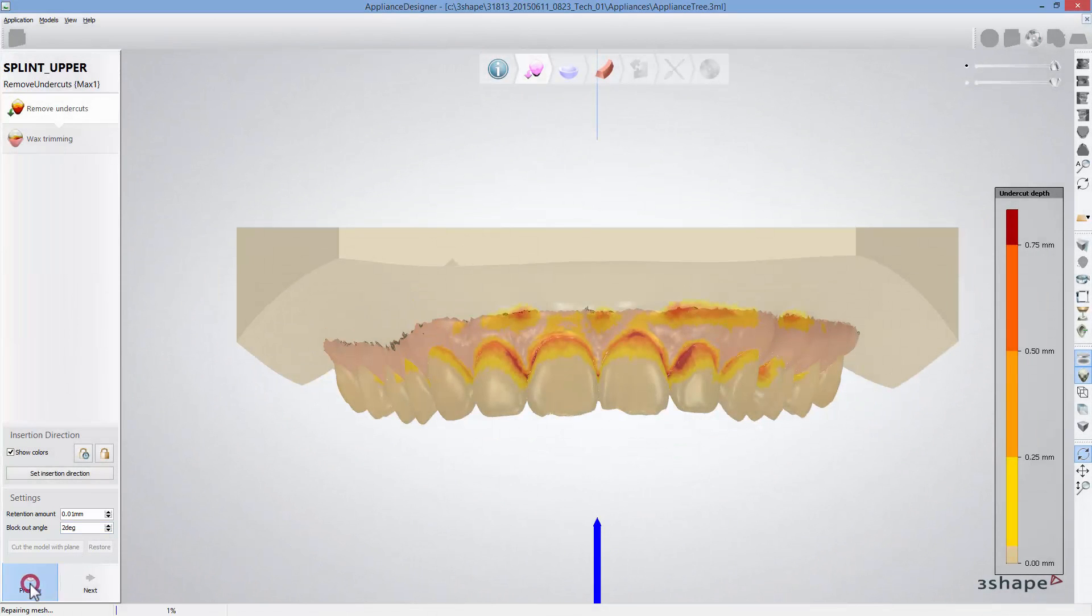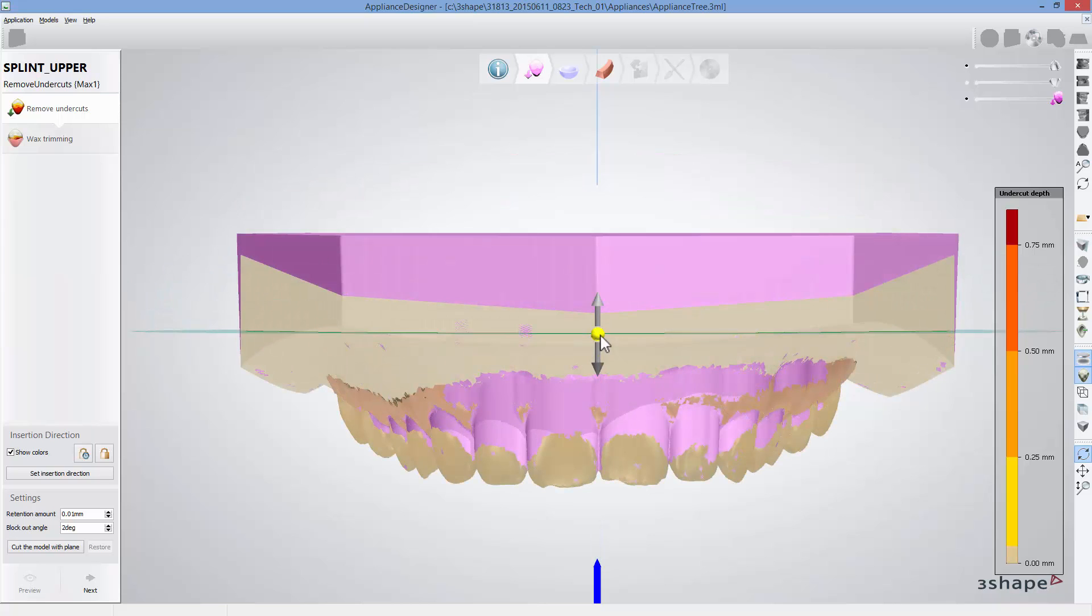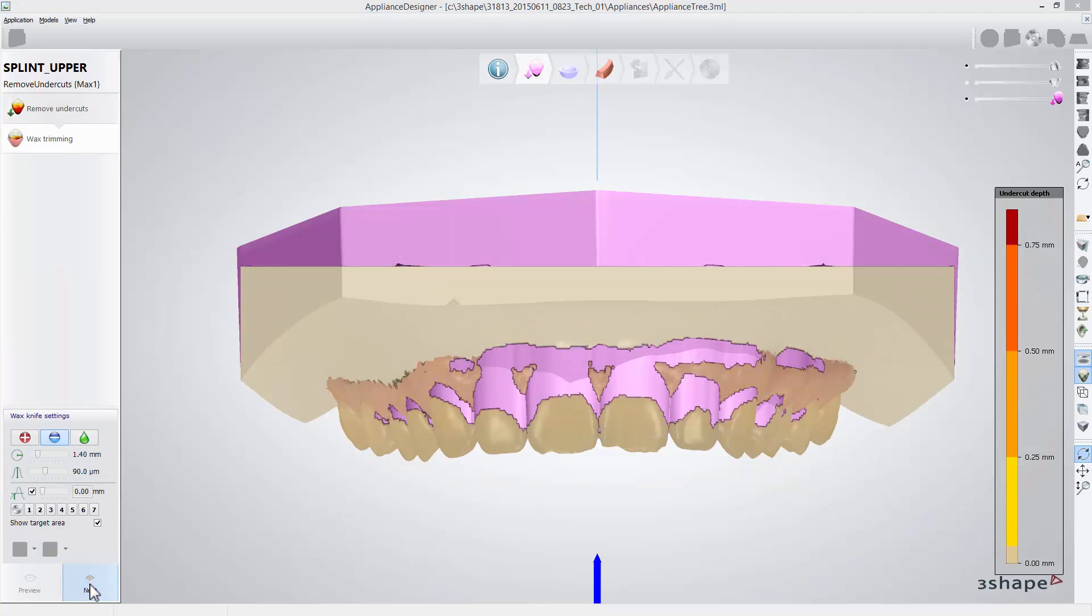Click preview to see your settings applied and use the plane to cut the size of the model base. Then click next to get to the wax trimming step where you can do the final adjustments to the blocking out material using wax knife.